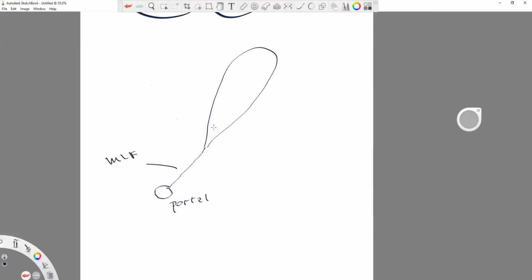It's posterior to the liver. It lays within the main lobar fissure, but it's still posterior to the liver, up to a portal vein, which is clearly in the liver. As we go further through the liver, we will eventually also find in the same general plane the middle hepatic vein, because the middle hepatic vein lays within the main lobar fissure.